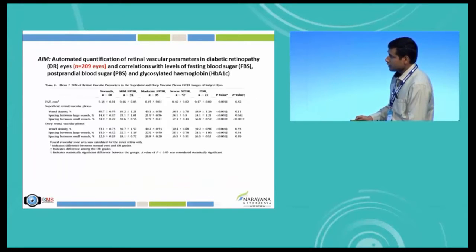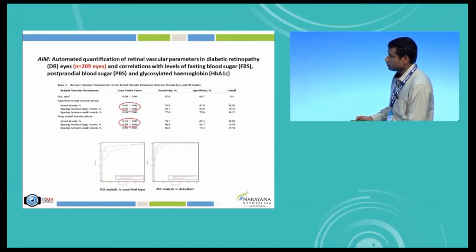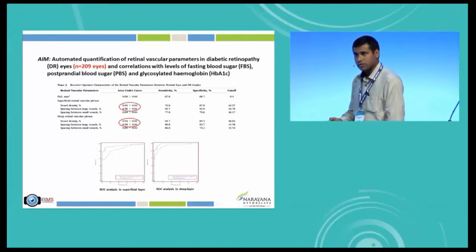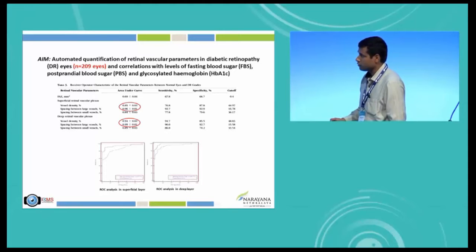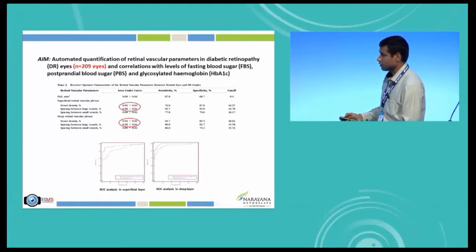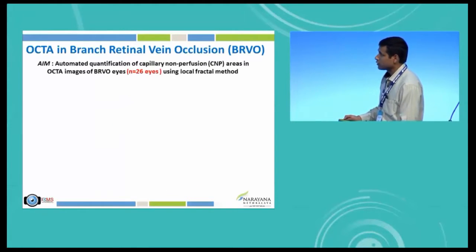We also looked at the ROC, that is the diagnostic criteria, and the method works quite well — we got very high ROCs in distinguishing diabetic retinopathy eyes from normal eyes.